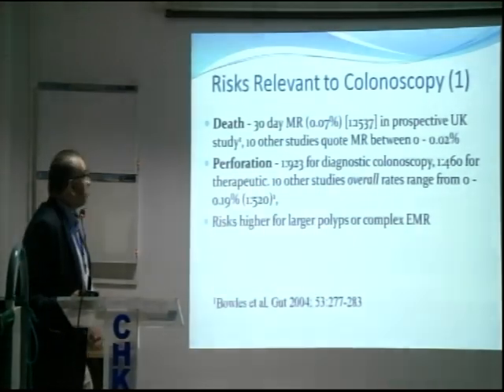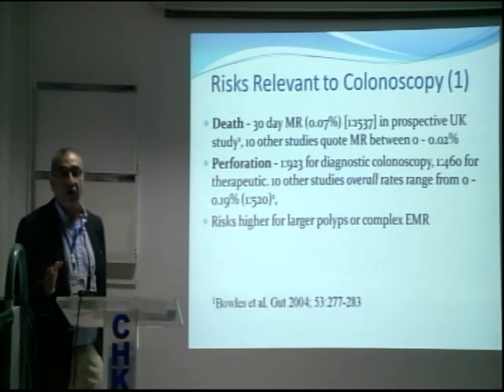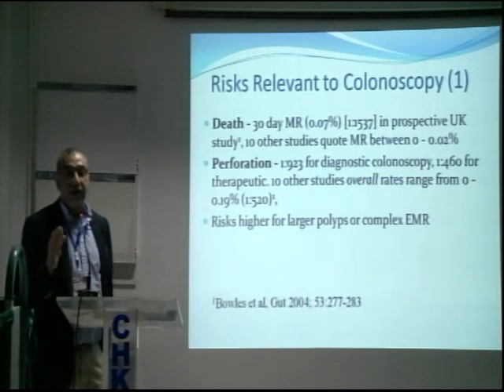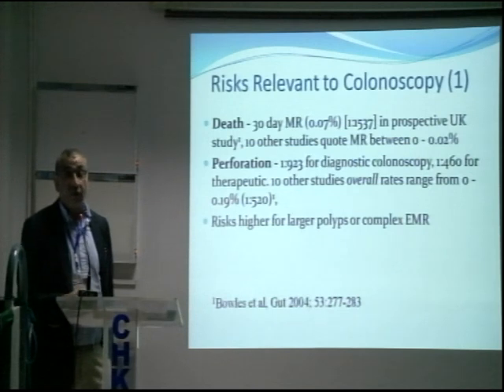Right, okay, basically, we'll go straight to the complications of colonoscopy. Like any practical procedure, colonoscopy has its own set of complications. One has to be conscious of that before starting the procedure and in the consent process, because your patient should be aware of what they are letting themselves in for. Whilst you are consenting them for a procedure like colonoscopy, you are obliged to tell them the well-recognized possible complications and what incidence they have.